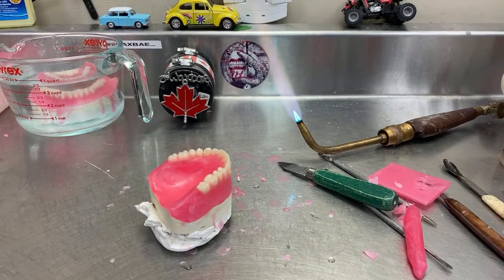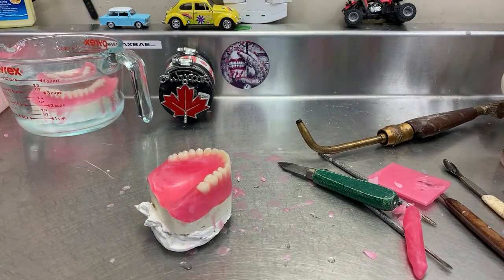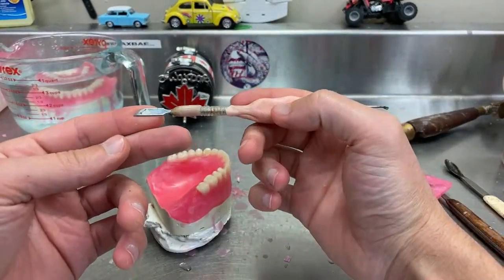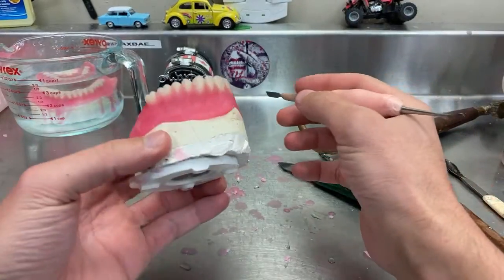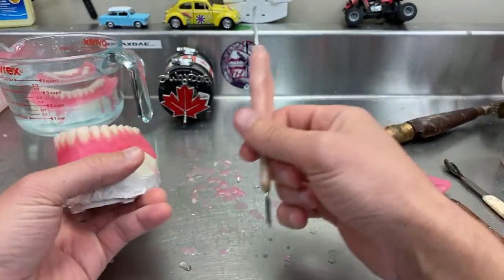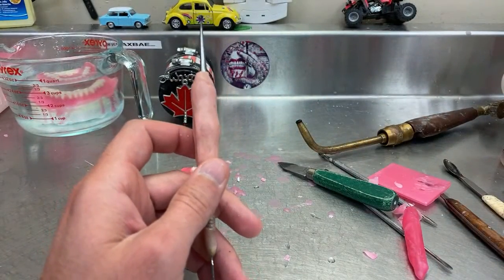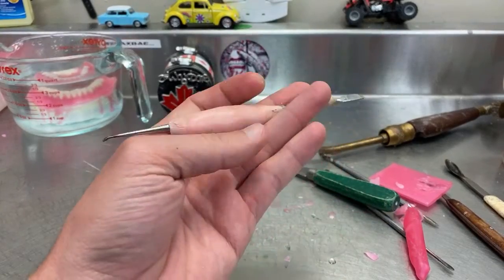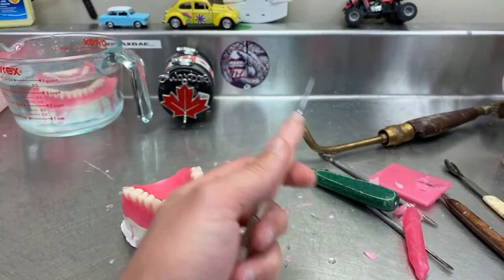So now this is all cooled down and safe for carving. I'm gonna be using this one here. Somebody asked me why you don't use Lacron, and honestly, I don't even have an answer for that. I use it whenever I feel like I'm using it, and you should do the same too. Don't use a tool just because I use it at that stage. Maybe I'm comfortable with it, but you are not. So always work with what's comfortable for you.